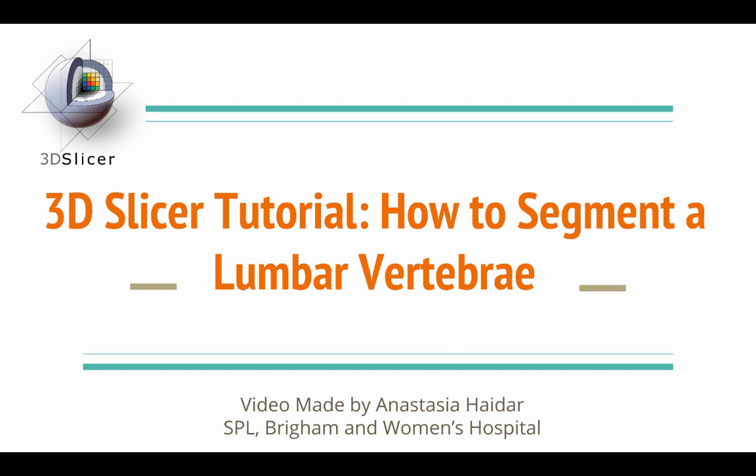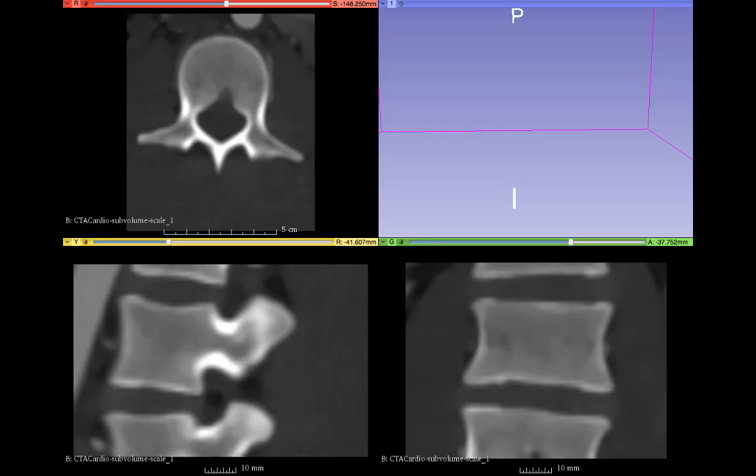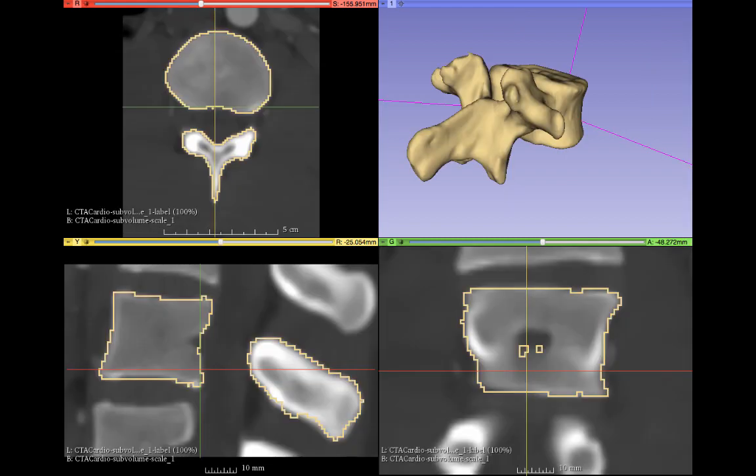Hello everyone, and welcome to a tutorial on how to load and segment a set of data using 3D Slicer. The next four images show the process of segmentation and the final result, even after 3D printing.